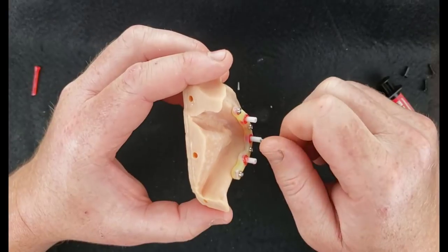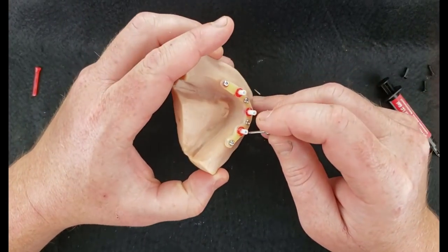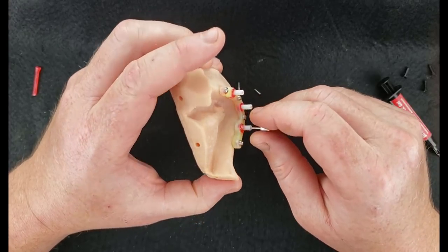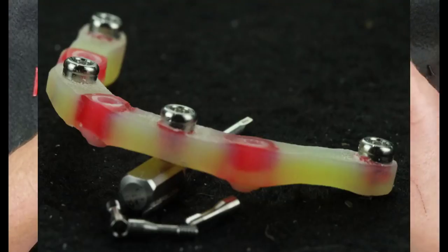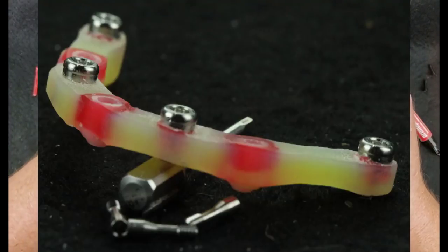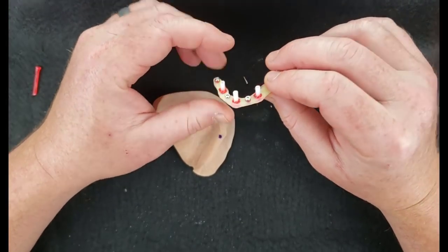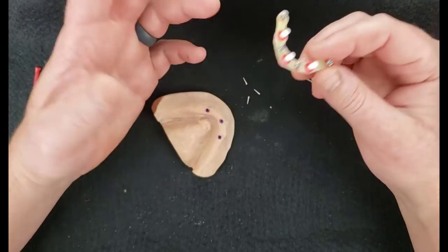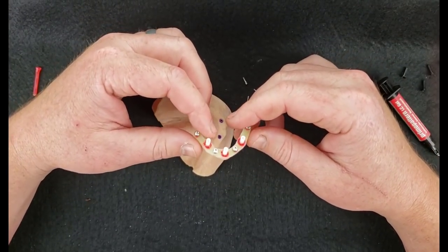Any little gaps that may be left between the UCLA cylinder and our printed bar, we would just go back and fill those in. And then finally go and chop off the tops of these cylinders where they're sticking out excessively. And then this would be ready to send for casting. And you can send this to whatever lab you want. If you've got a local lab that does a nice job at casting, they can do that.